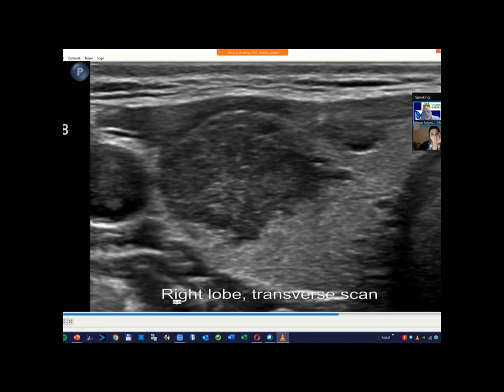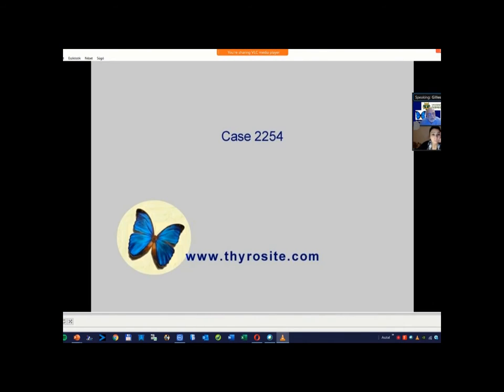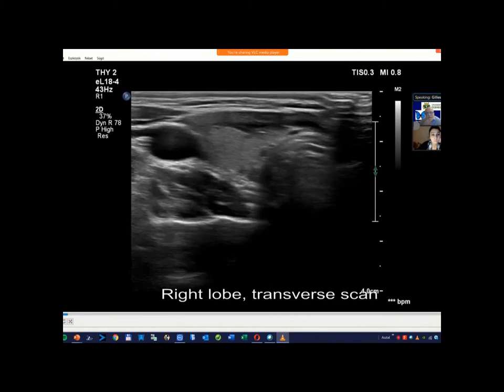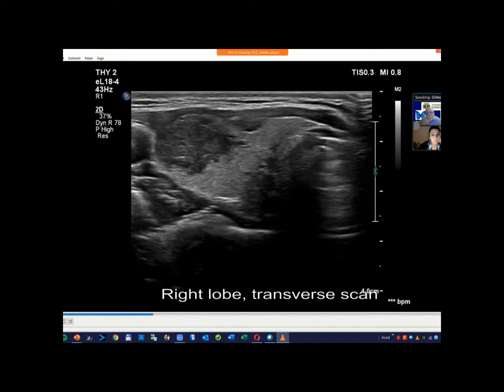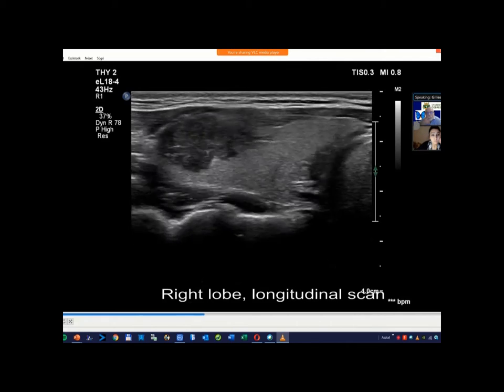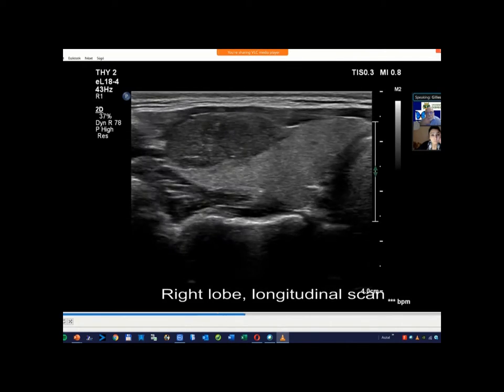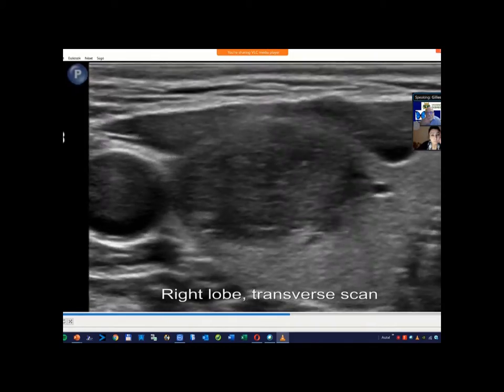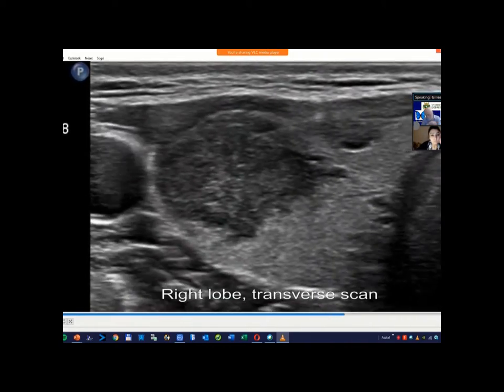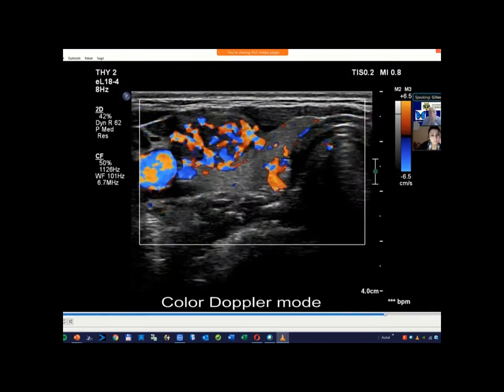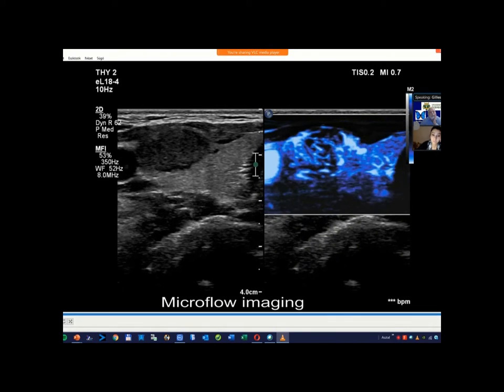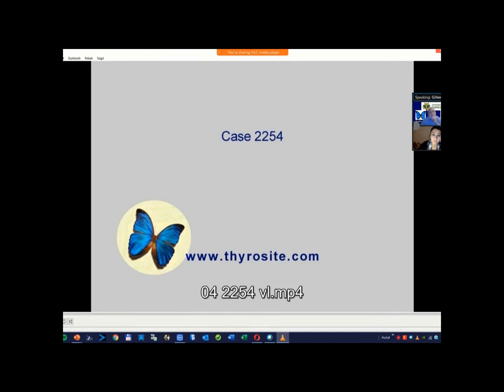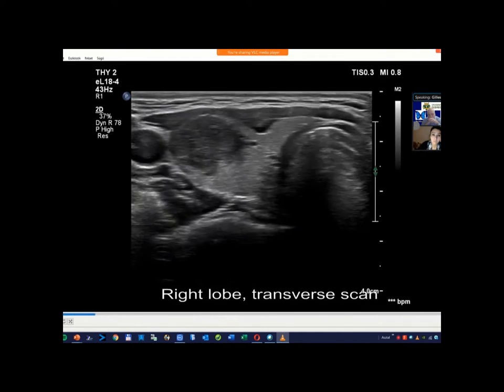Regarding cometary tail artifacts, they are not mandatorily typical for benignity, because you have to separate at least two types of cometary tail artifacts. You have to take into account the ones that are more than 0.5 millimeters — which are rather large ones inside the cystic part of the nodule — and the others that are very tiny, like this one, which is a true cometary tail artifact but less than 0.5 millimeters, and rather located in the solid part of the nodule, because there are no real microcystic cavities in it.